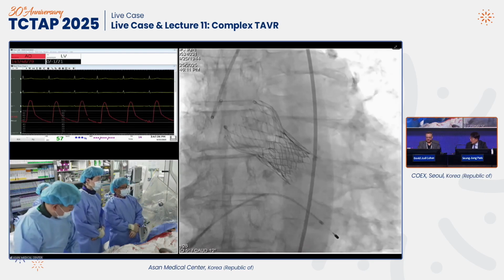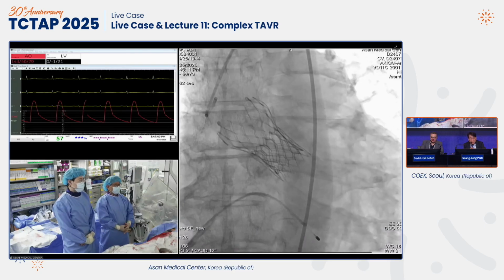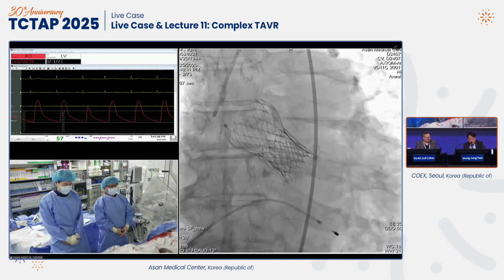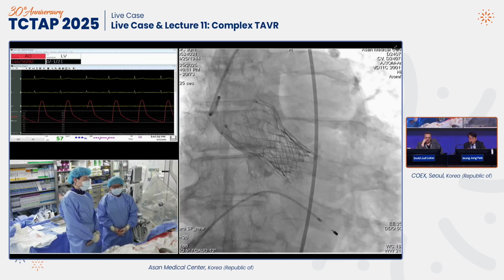Perfect. Very nice. Great. So it's a very, very nice result. Anybody want to do anything else other than high five and close the groin? Good cases, Dr. Very beautiful result, Jung-Min. Very well planned.